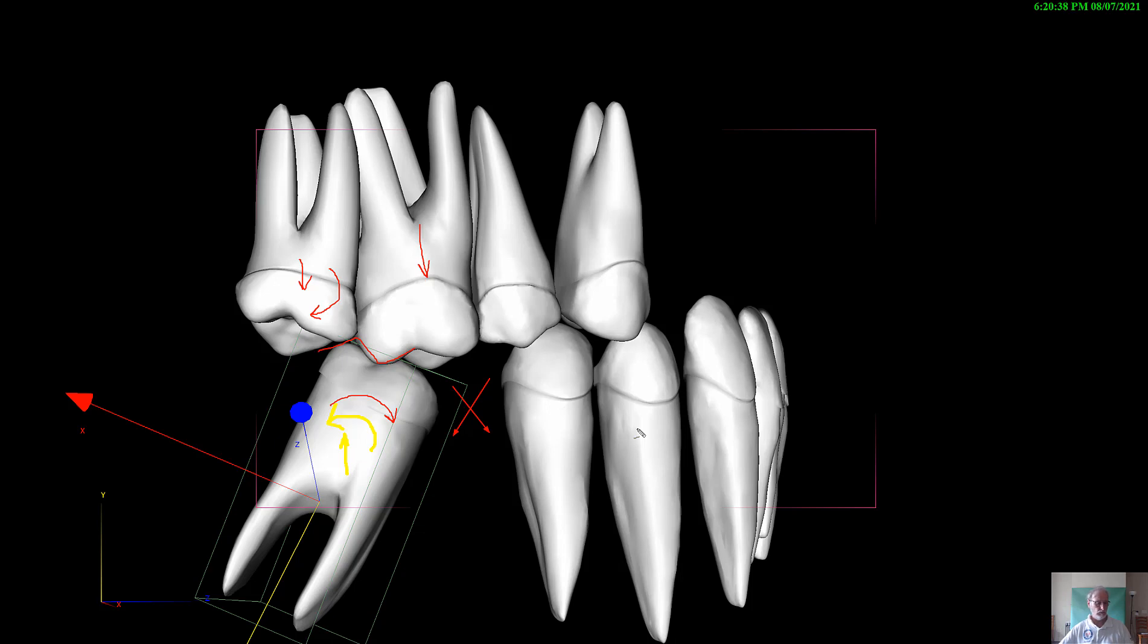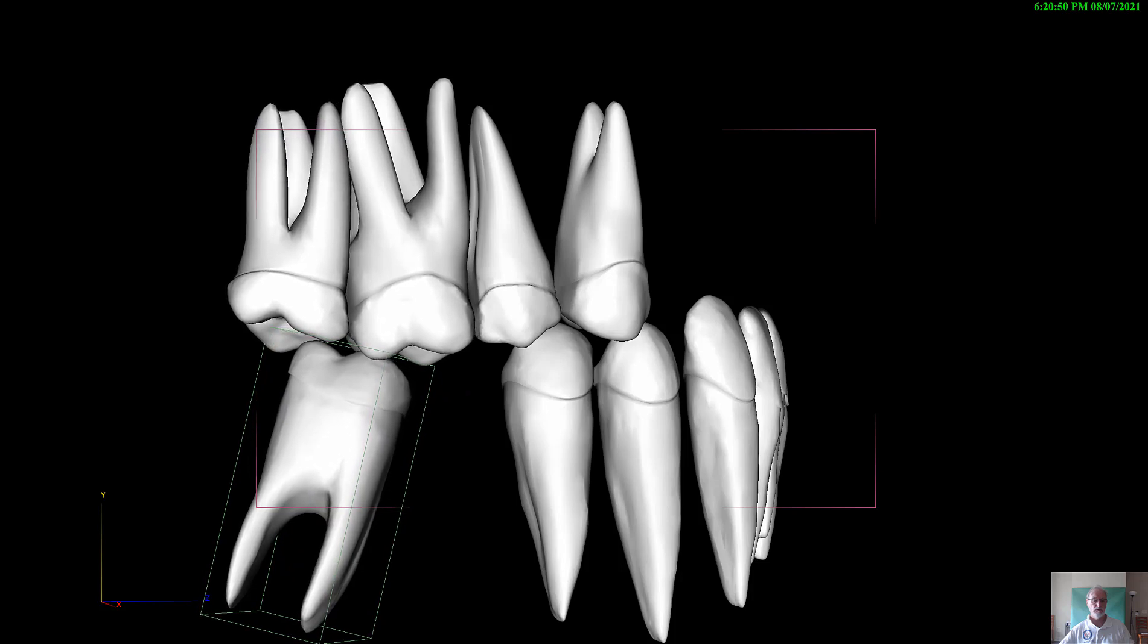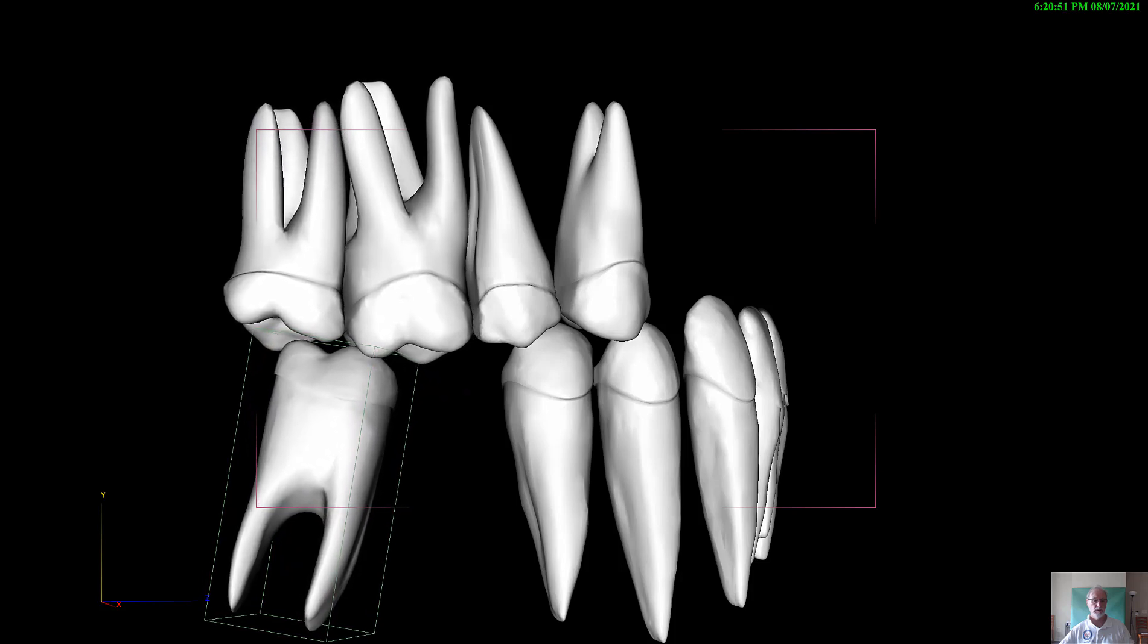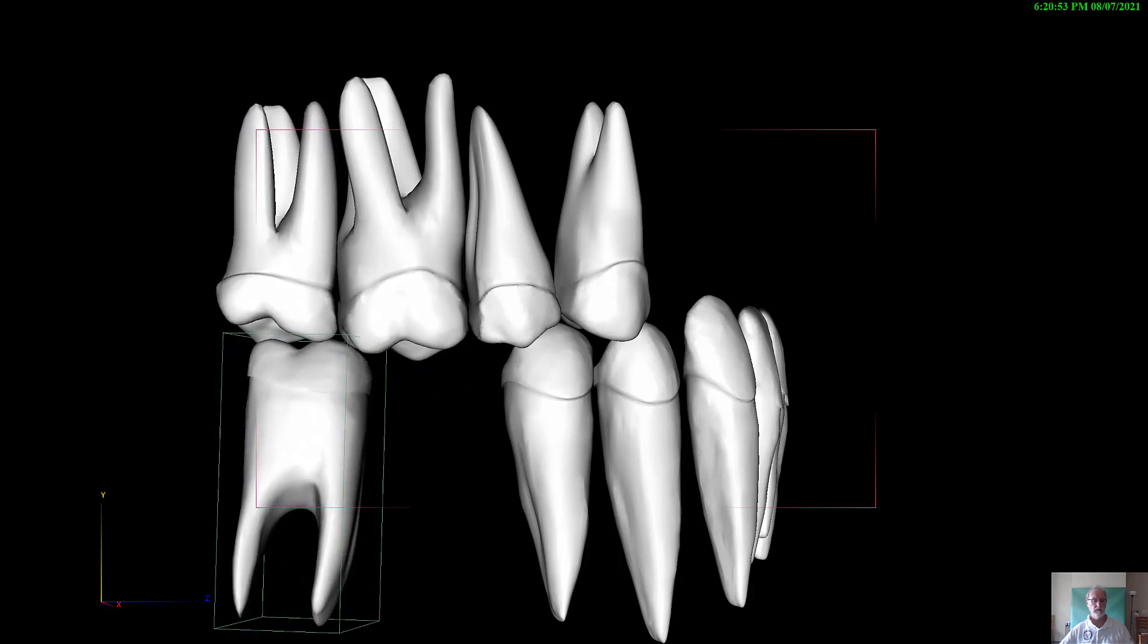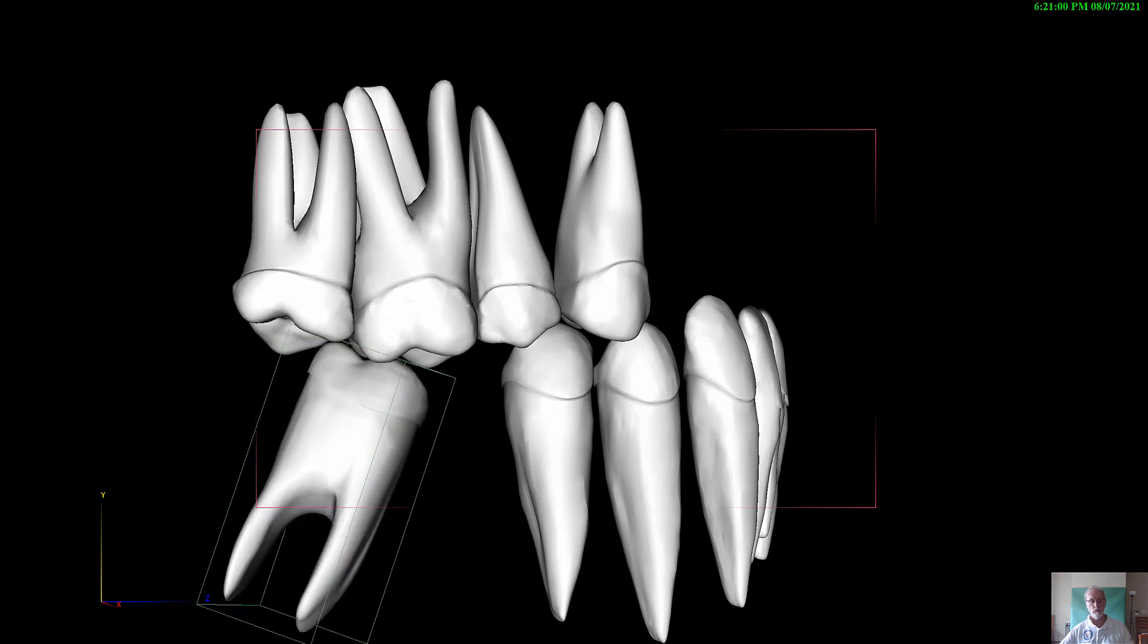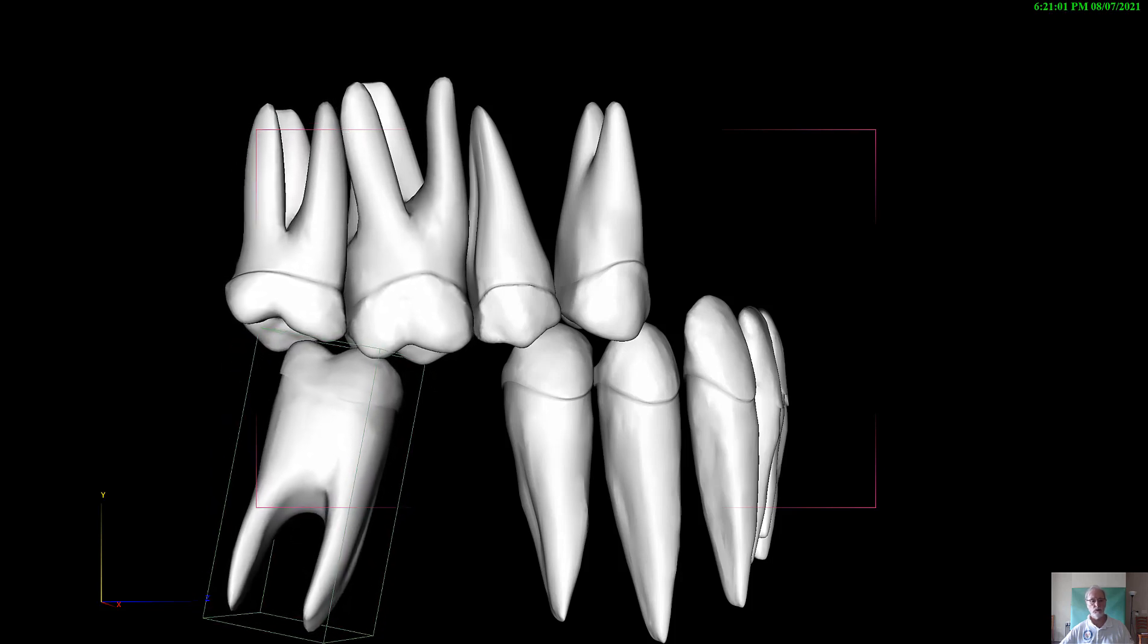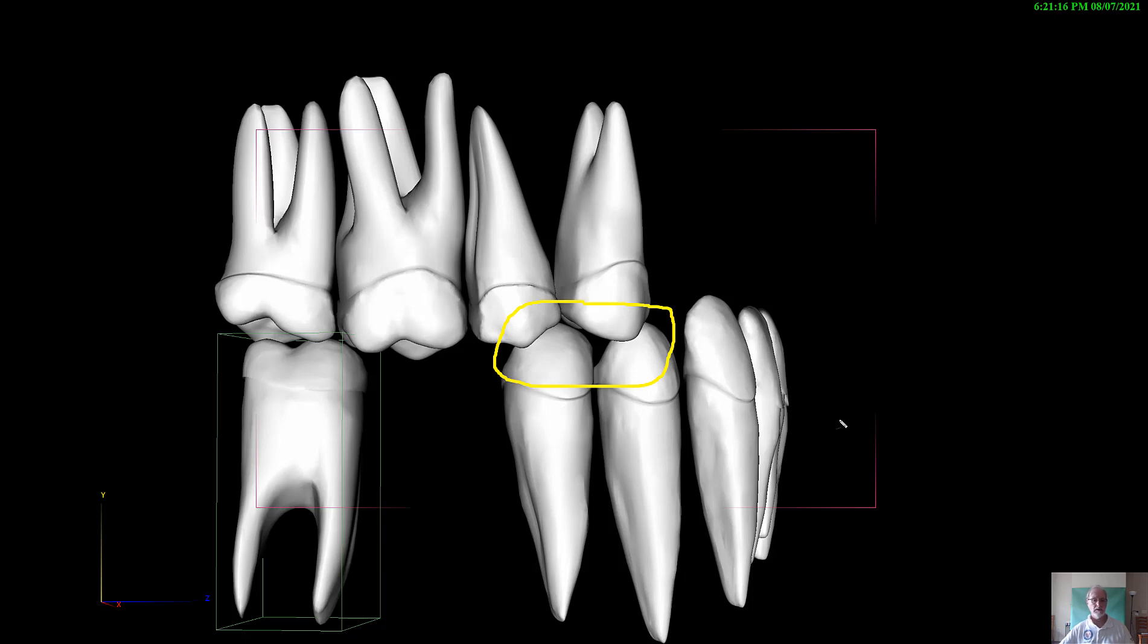Let's see what the desired movement will be. So the desired movement is I want this tooth to extrude. Basically, the first molar is intruding, the second molar is torquing, the second lower molar is actually uprighting and rotating without too much extrusion. You notice that we also have definitely left the occlusion as identical as possible without opening the bite, and that's a very important aspect of what we do.